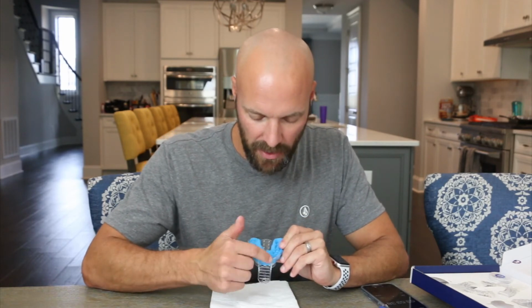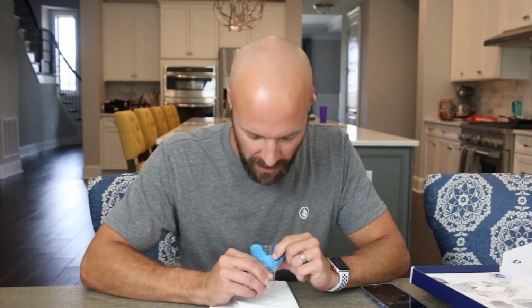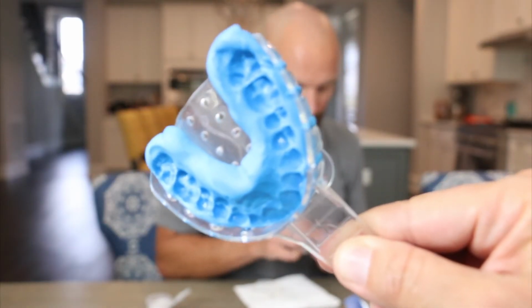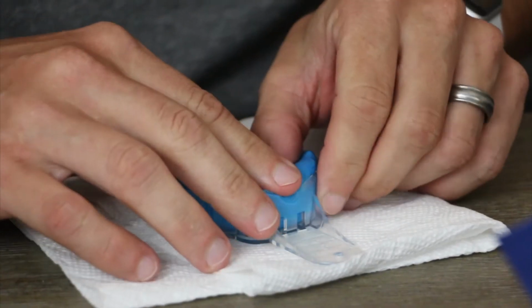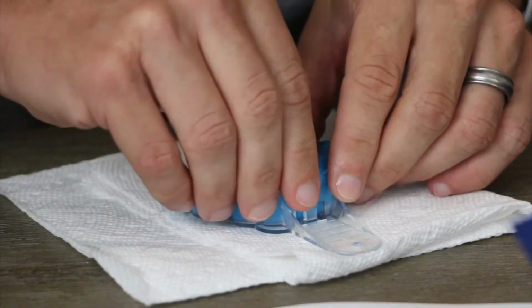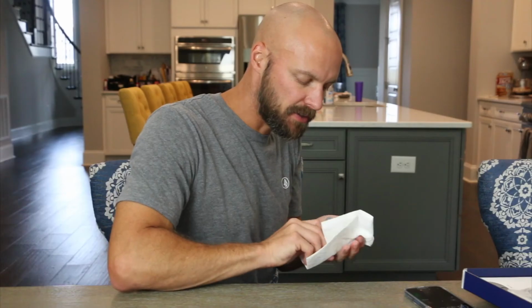Because basically when I made my impression, I didn't push as much in the front as I should, and you have to kind of set your teeth back. Otherwise, clearly you can see from mine that you're not gonna get my front teeth in the impression. So I'm gonna do it again. Take 2. What I'm doing the second time that I didn't do the first time is I'm pushing it way up in the front. Nope, wrong again. We just did the top.